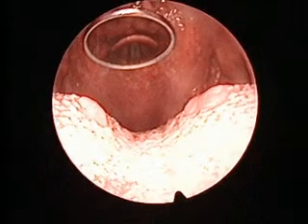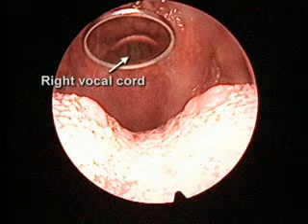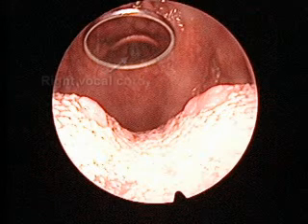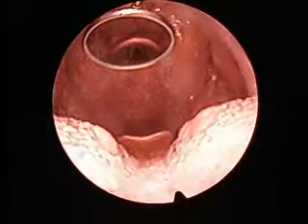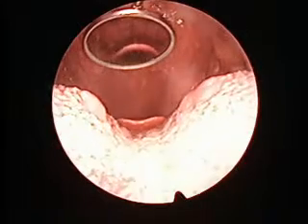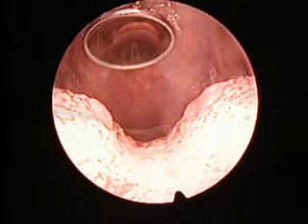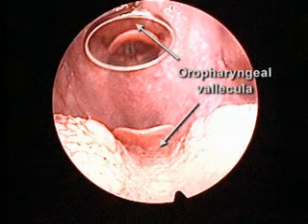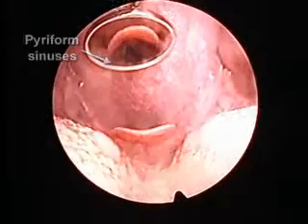E. With mirror laryngoscopy, the image is inverted. In other words, the right vocal cord appears on the left side of the examiner's view on the mirror, and vice versa. The anterior aspect of the larynx can be seen by asking the patient to say "E" in an even higher register. This fully visualizes the anterior commissure. The oropharyngeal vallecula and the piriform sinuses in the hypopharynx are also visualized and should be inspected for symmetry.